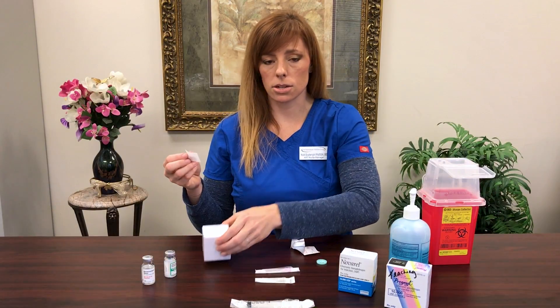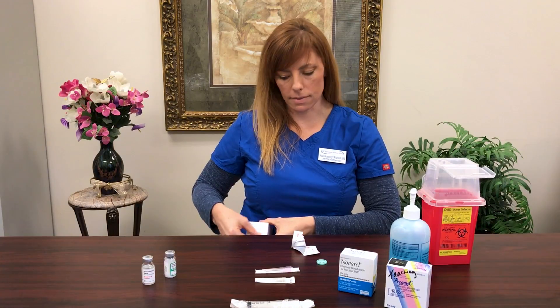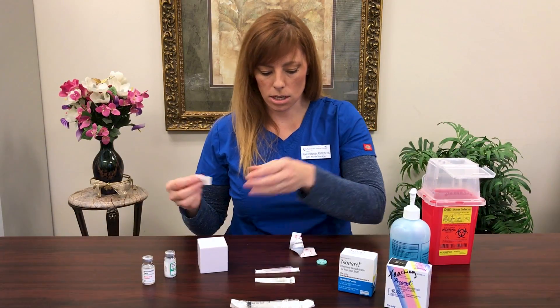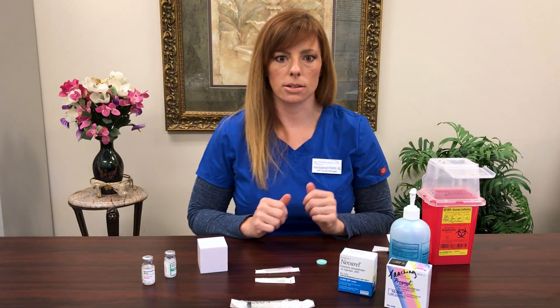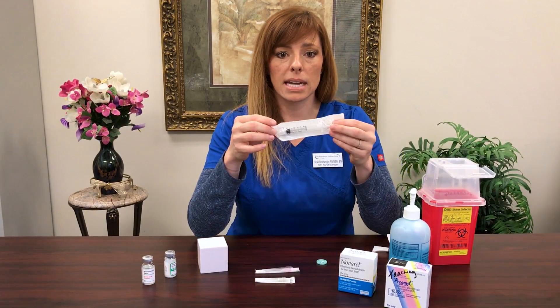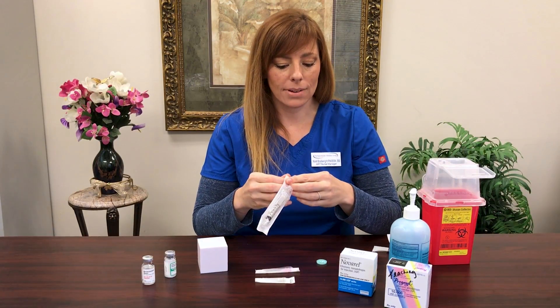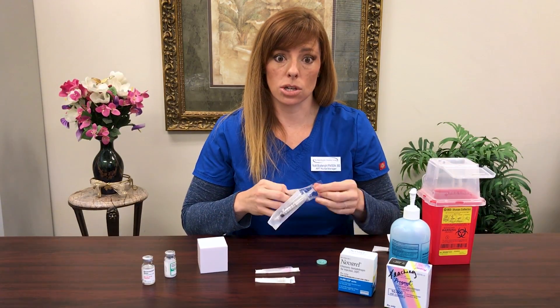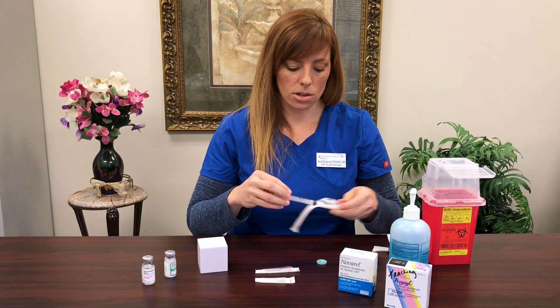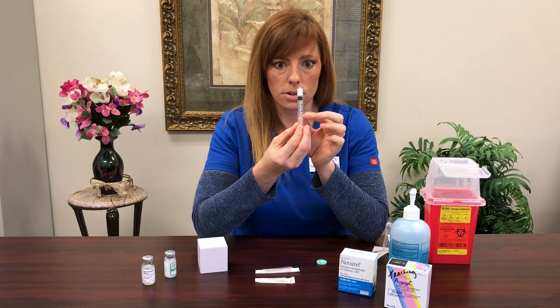Then I want you to prep your skin. This is that lovely muffin top that we love so much — the only time we love it in life is when we're doing IVF. So you've cleaned your skin, you let that air dry, set aside your alcohol swab. The very next thing I want you to do is to find your 3cc syringe. This is probably different than some of the syringes you've used in your stimulation so far, so make sure there's a 3ml or 3cc on the bottom of your syringe.